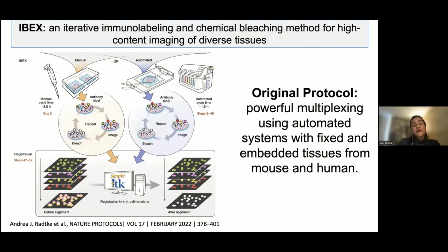So what you do is you image your tissue, and if you have many different cycles, for example, in this example here, you have 4 different cycles of staining. You later use computer programs and algorithms to align the samples that you took from the very same slice, and then you end up with a number of different markers in the same tissue in the same place. So we were really very interested in that.